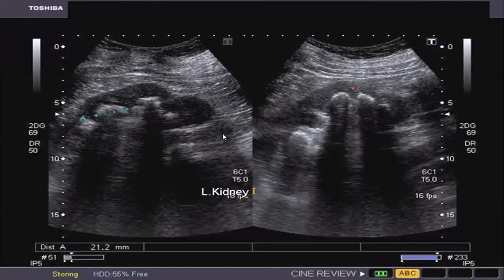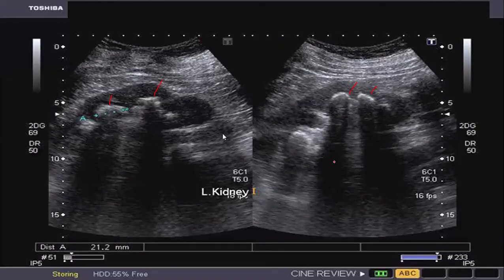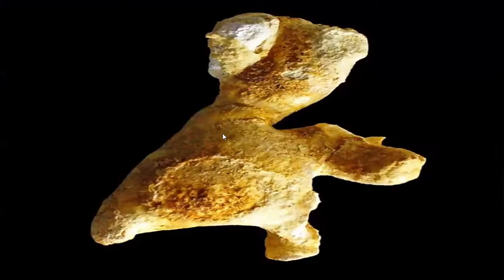But what you see are these ones. Can you get me, doctor? Yes, Doc. These areas here are obscured only by the shadow. So that is a Staghorn. This was obscured by the shadowing here. Well, you see this one.